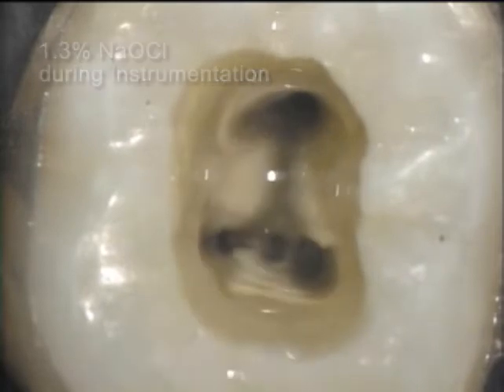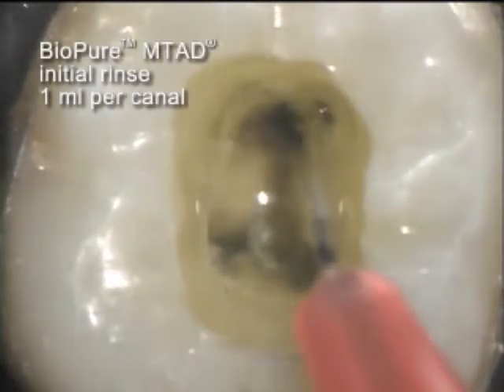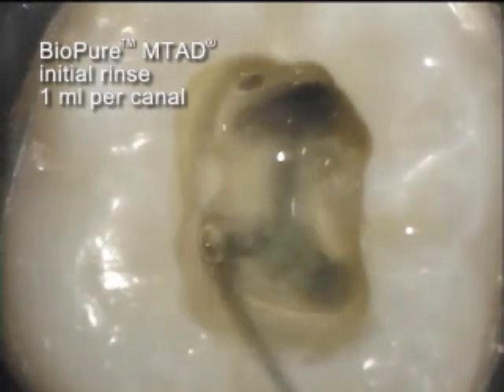After another rinse with the bleach solution, the BioPure MTAD is introduced. Notice the reaction which appears almost immediately upon contact with the BioPure MTAD solution.